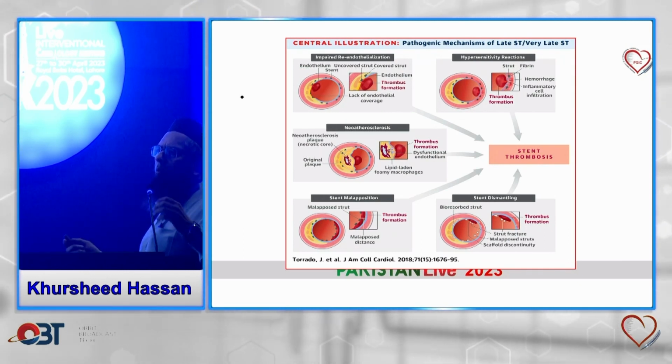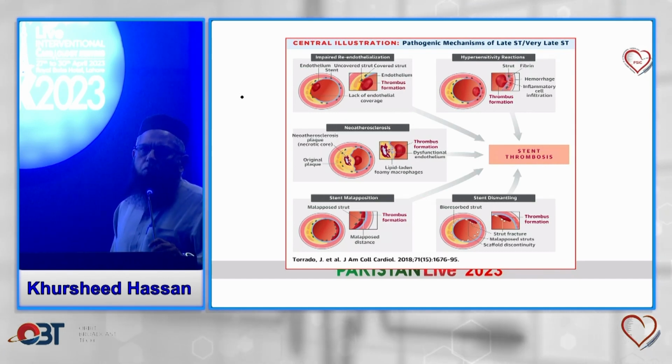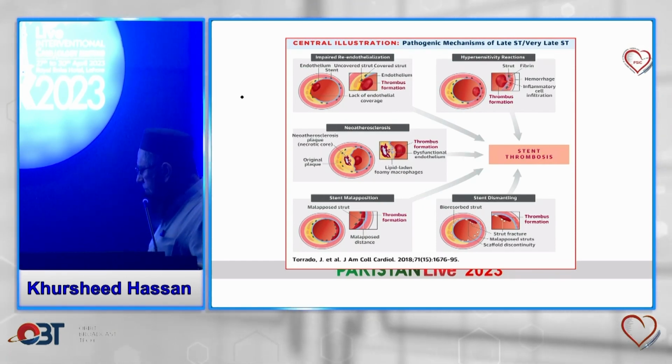This was more so a problem with the first generation stents actually. Now a lot of changes have been made, and this is now less common as compared to previously, but still occurs.